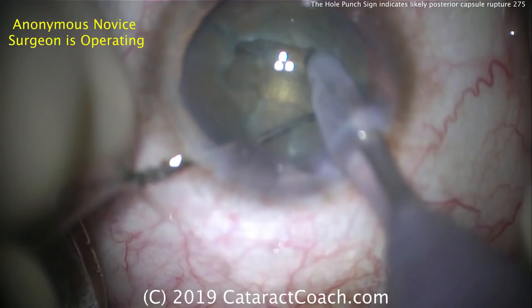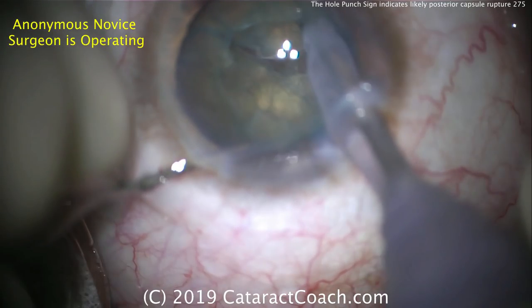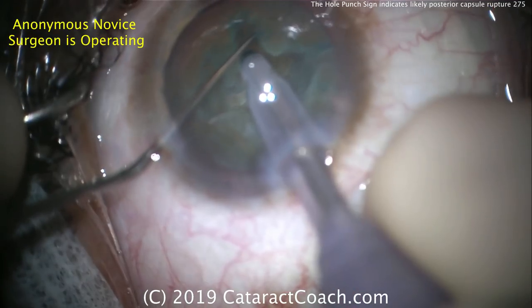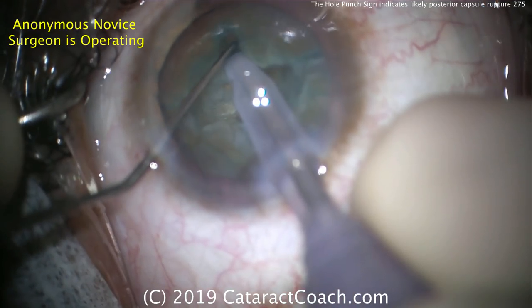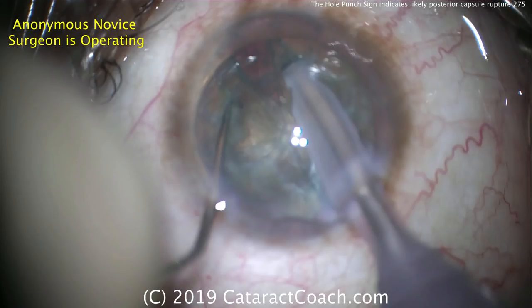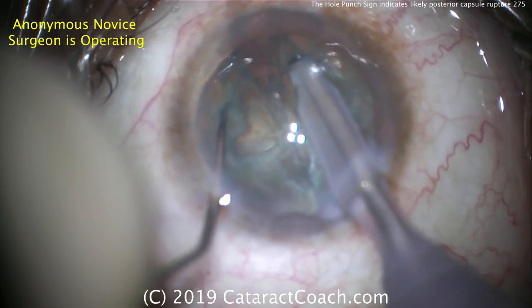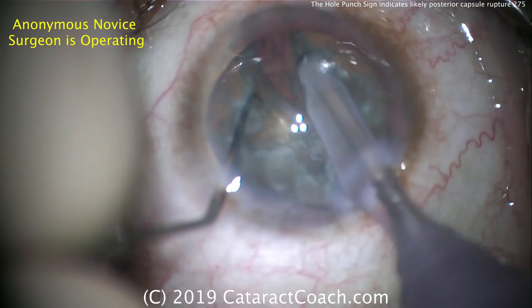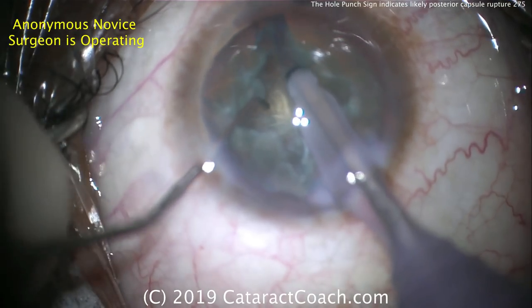There's an initial groove in the nucleus. Trying to split the nucleus — it looks like it's mostly apart. Now rotating the nucleus to do four quadrants, so it looks like a divide and conquer technique. Again, splitting the nucleus — there's a good split. But is the split all the way through? Are the four quadrants fully separated? That's only about halfway.